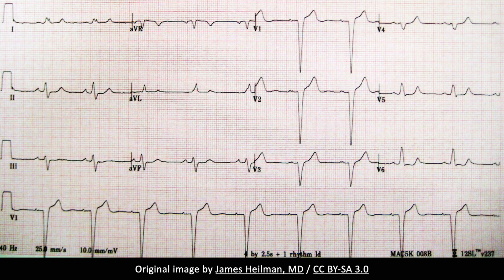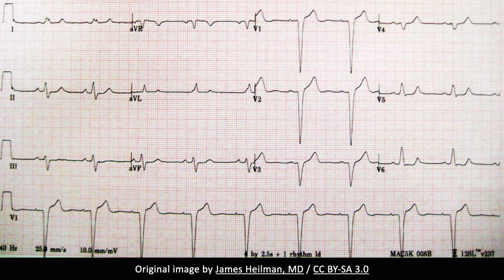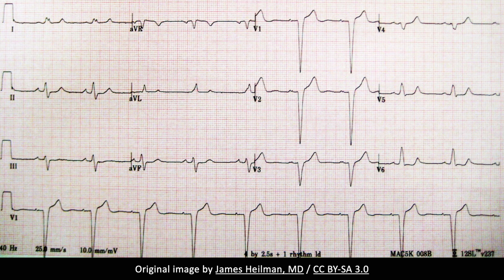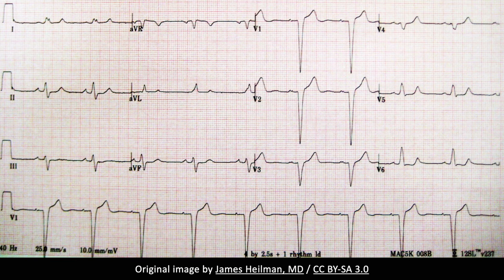Also note that the ST segment and the accompanying T waves can be deflected in the opposite direction of the QRS complex. This is referred to as discordance. Essentially, when the QRS complex is positive, the T wave is inverted, and vice versa. Finally, with left bundle branch block, the axis is usually deviated leftward, however it may be normal.